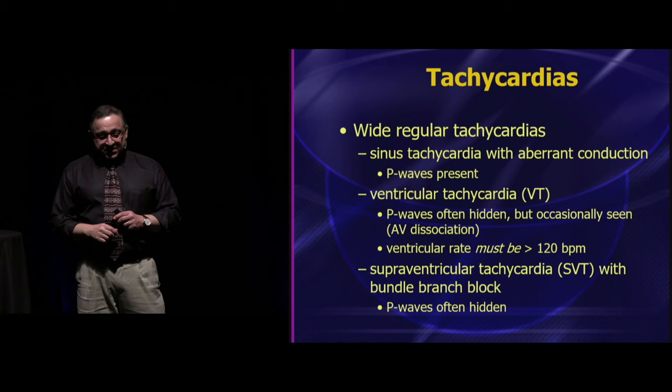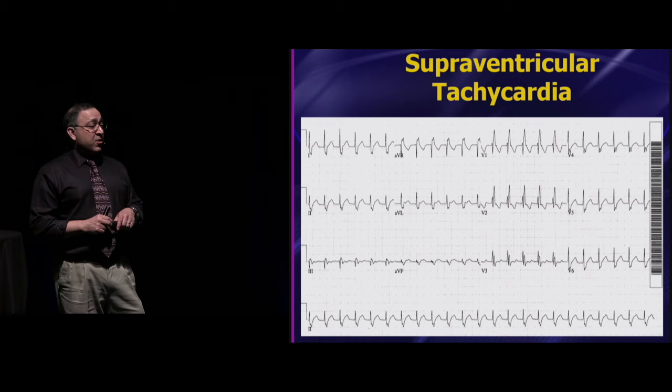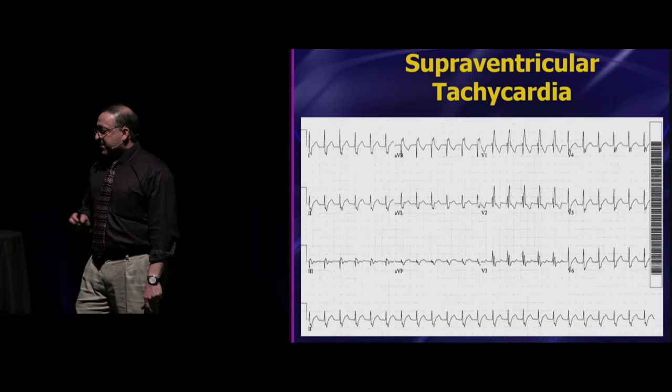We'll talk about that in just a bit. All right? So here's your classic ventricular tachycardia. It's regular. It's wide. All right? Here's SVT with a right bundle. Now, be very careful about calling this SVT with the right bundle. And again, I mentioned I'm probably doing you a disservice by even talking about this.